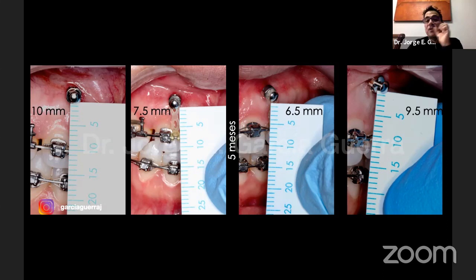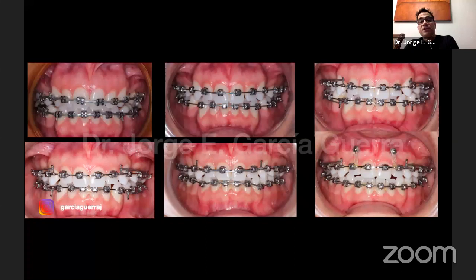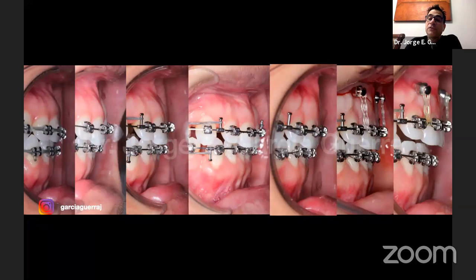The one on the left moved a little bit, so that's why I think there's a little more movement there. But here we can see the progression, how we had the overbite at the beginning and how we've been correcting it with changing the position of the brackets and the use of mini implants. You can see here on the overbite pictures. You can also do this with a utility arch or intrusion Ricketts arch, but for me, it's easier to do this with mini implants.